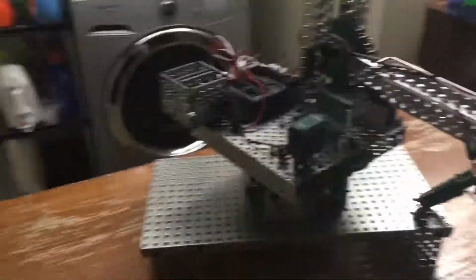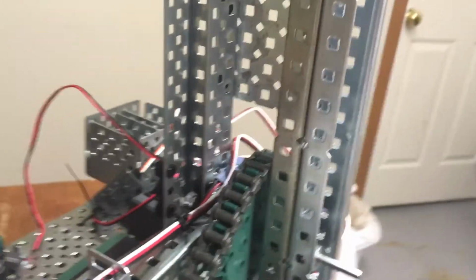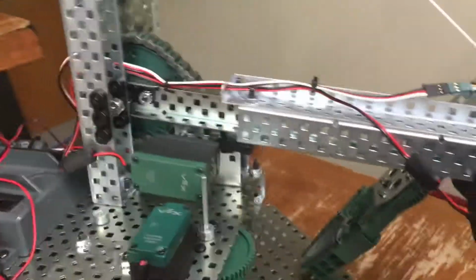Now, here is an overview look at the actual project itself. Of course, we have about 3 to 4 different sections of the build itself. And what we can do is get the whole thing to turn about its axis. Here, actually, this way would be better. This is unpowered at the moment because we don't have the ability to power it here.